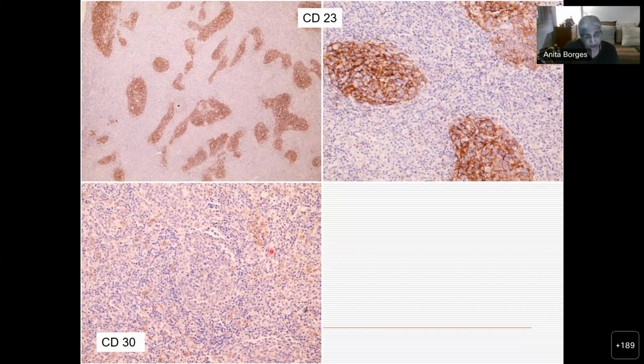So what is it? It's not likely to be a T cell lymphoma because the T cells are small and very evenly distributed. What kind of B cell lymphoma can it be? Do you think it's a follicular B cell lymphoma? Then you are not going to see these very odd-shaped follicles. And this guy has had lymphadenopathy for 6 months. It is generalized. So you have to ask yourself, it's very difficult to put this into any kind of lymphoma. What kind of reactive or benign condition can it be?